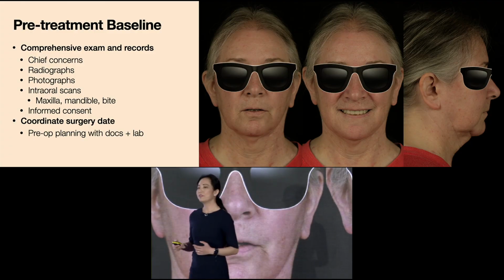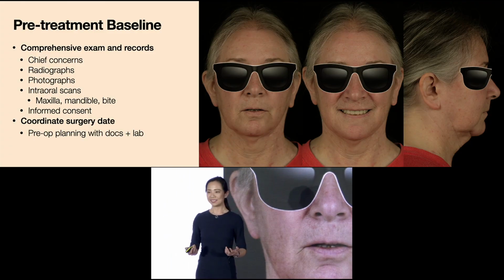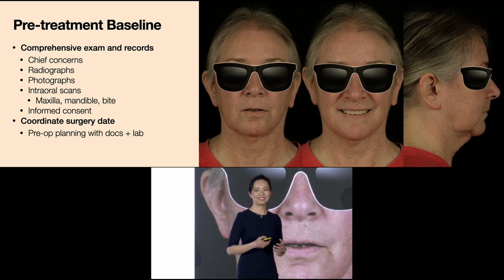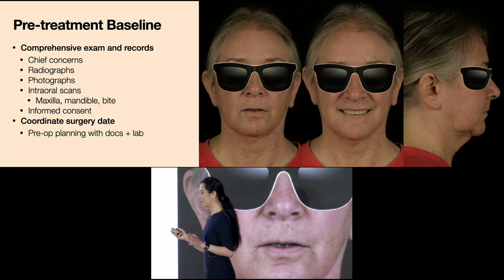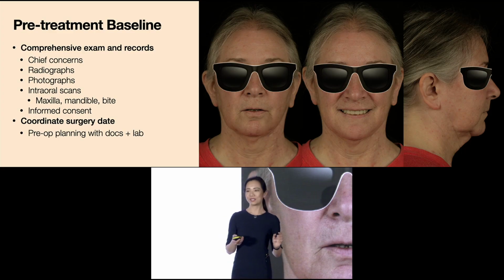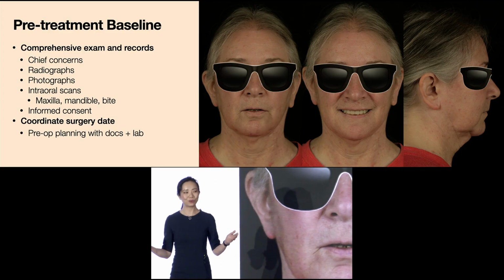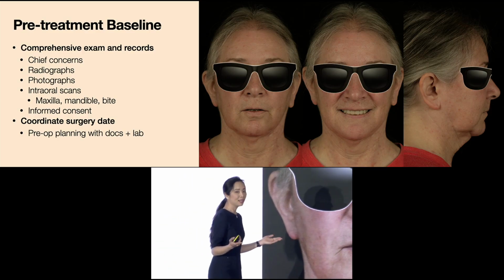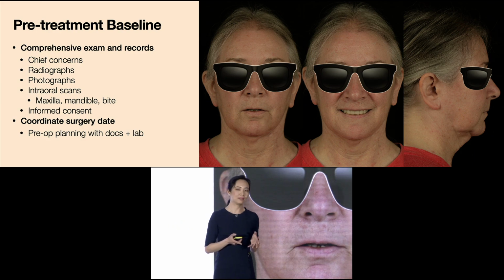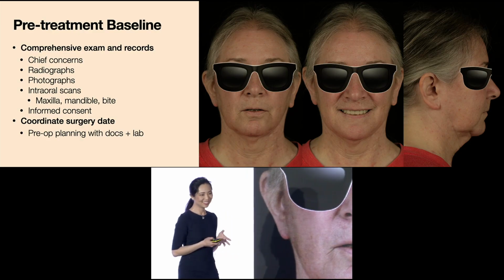How long or how many visits would it take you if you had to make a denture or an immediate denture conventionally? You don't have to say any real numbers, but the reality is that most people will take at least 2 visits if you're working with alginate impression, or up to 6 visits if you want to go through a whole try-in process, right? But now you do a digital design, we can boil it down to just 1 visit, because as long as you have the design on file, we can turn it into anything.